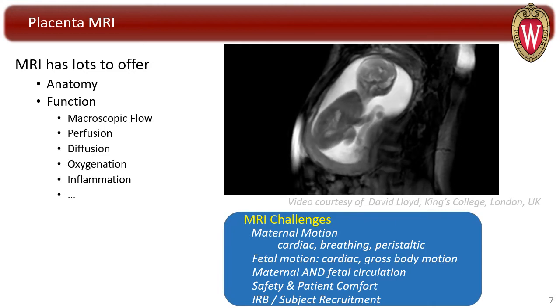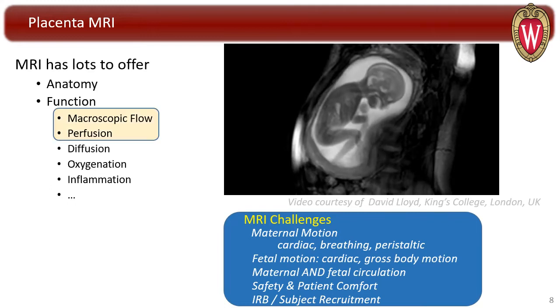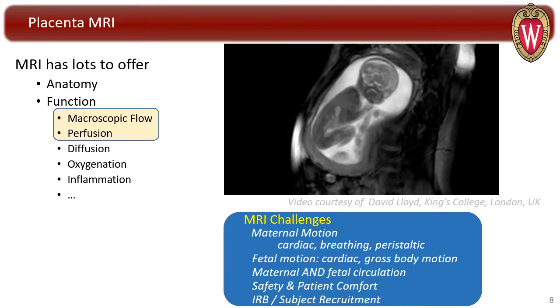Challenges include the presence of maternal and fetal motion, dual circulation, lack of thorough safety studies, and reduced patient comfort. Here, we will focus on the use of MRA to assess vascular anatomy as well as flow and perfusion.